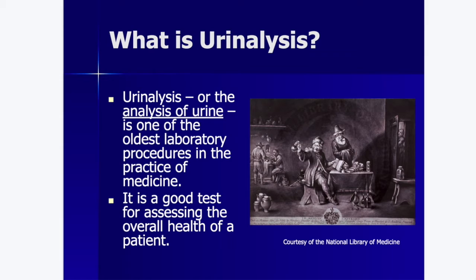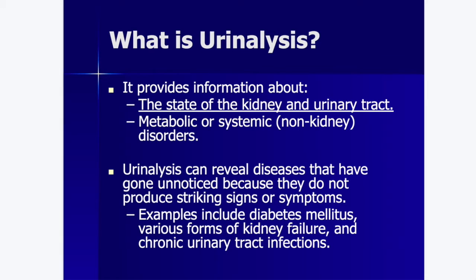So urinalysis, what is it? It is basically the analysis of urine, kind of like the name tells us. It's one of the oldest lab procedures done in medicine, and it's a good test for doctors to get an overall idea of the health of a patient. It's going to give information about the state of the kidney as well as the urinary tract, so you can see if there's an infection or kidney stones or any problems like that.